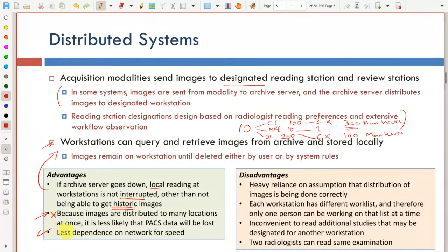Here, this is a real advantage because you're much less dependent on the network. For the server, the network connection is very critical, because you have so many different connections and you have to handle them all at once. You may have 100 or 150 very high-speed computers sending data to or receiving data from the server, each at maximum speed.